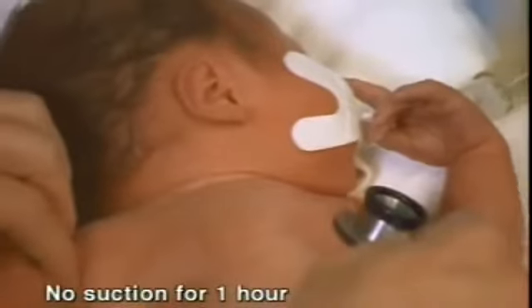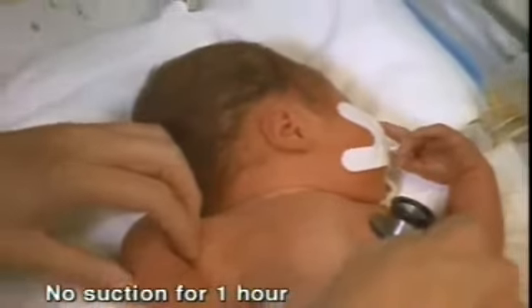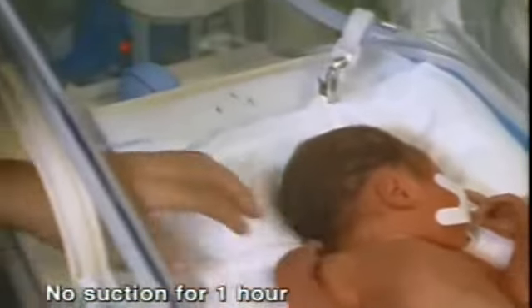In controlled clinical trials with Surfactant, the most commonly reported adverse events were transient bradycardia and oxygen desaturation. Don't suction the endotracheal tube within 1 hour following a treatment unless occlusion is suspected. Continue to ventilate as needed.